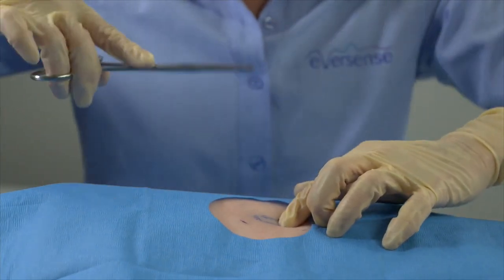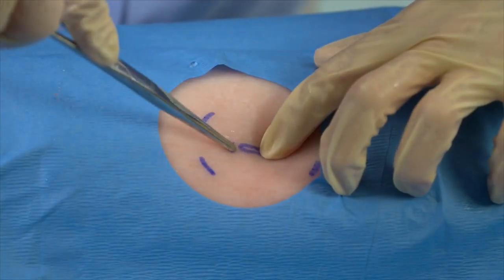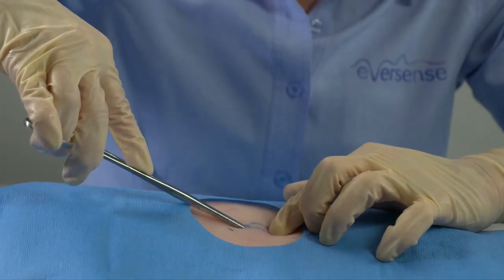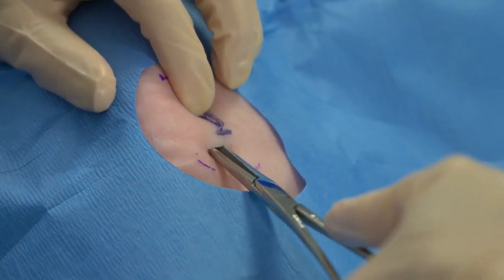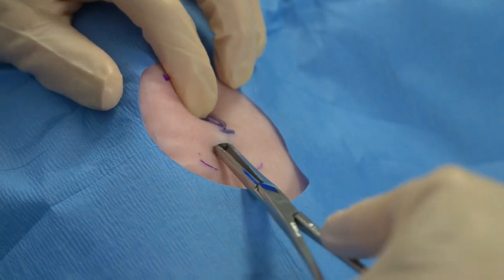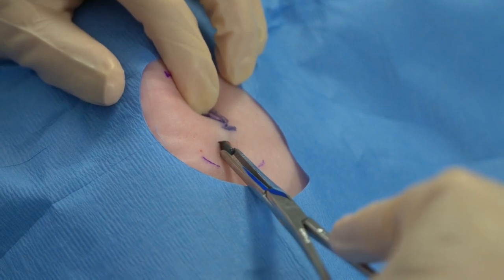Next, take your clamp and advance it through the incision with your hand facing down and the clamp jaws closed until you touch the end of the sensor. Listen and feel for the clamp touching the end of the sensor. Once you locate the sensor, open the clamp, advance it a few millimeters, and then gently close the clamp to secure the sensor. Once secured, do not lose your grasp of the sensor and the clamp.